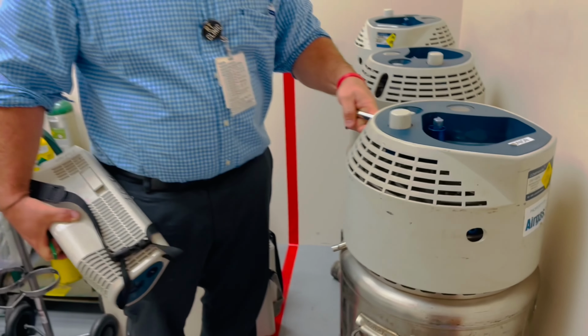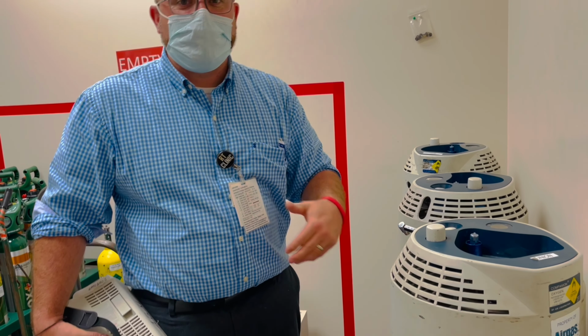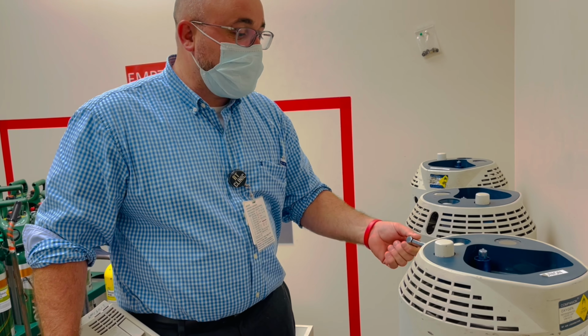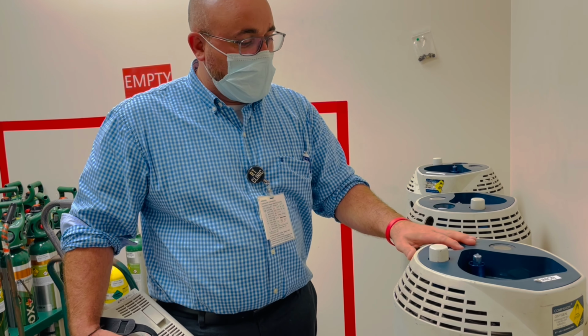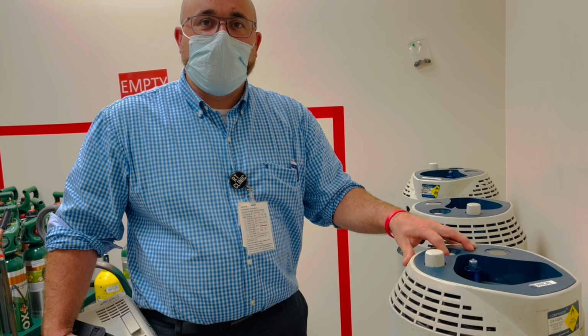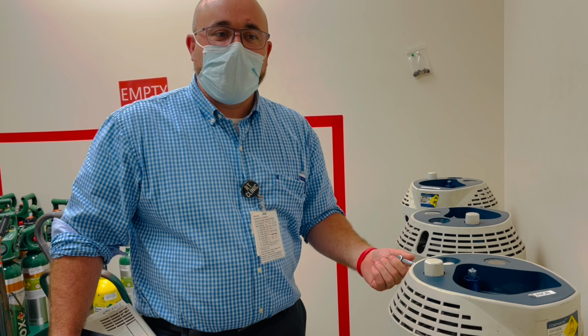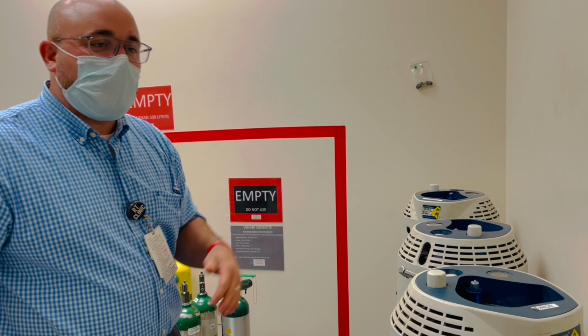The most amazing thing about this is liquid oxygen slowly, as it warms, turns into a gas and gets released. And the funny thing, not so funny, is if we buy one of these that's absolutely full and we let it sit here for a week, it will be empty. So what other way would you like to burn money than letting it float into the air? And that's what we do. But we have to have liquid oxygen for our patients.